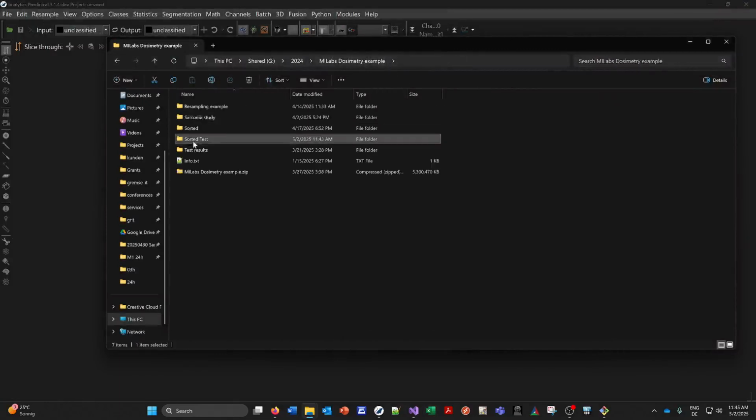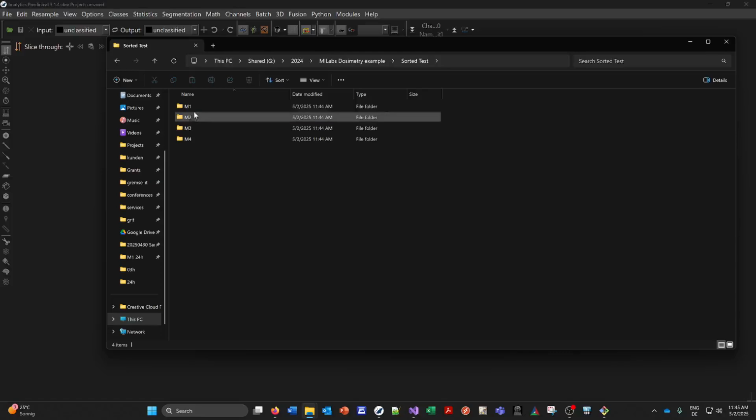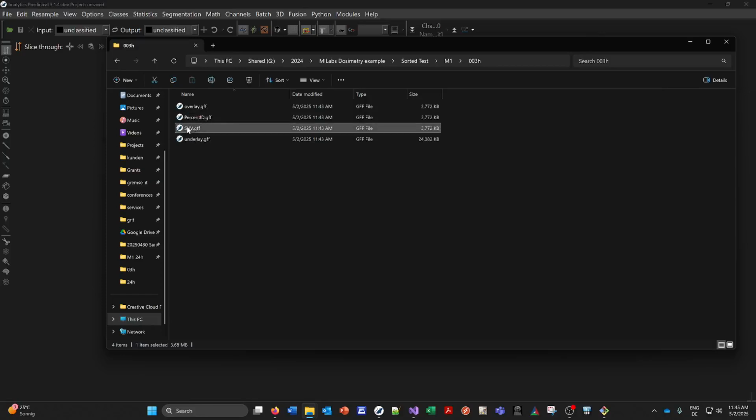And then you process your data, and you have this nice structure with one folder per mouse with multiple time points, and then you can move on with the segmentation and quantification, and you have these nice maps here in %ID and in SUV, and this one is in becquerel per ml.